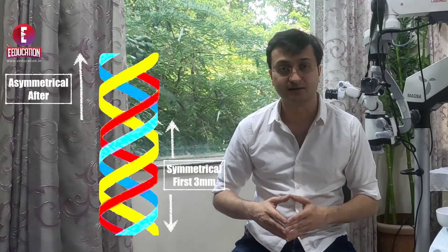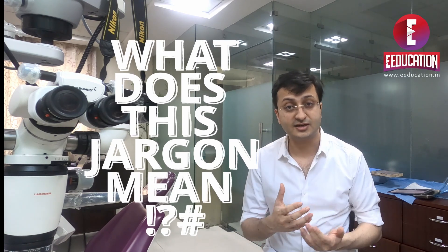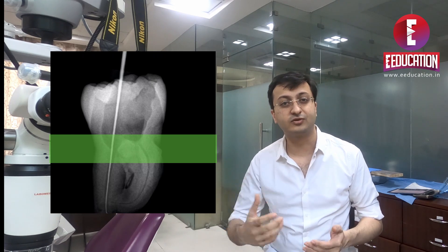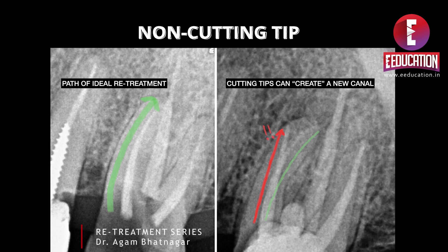As far as the rest of the construction goes, it is a triple helix which is symmetrical for the first 3mm, beyond which it becomes asymmetrical. This means we are talking about a file which will be friendly to the dentine and would not keep removing from the cervical area which needs to be conserved. Another important aspect is the non-cutting tip. An instrument with a cutting tip risks transporting the canal or creating a new path, as seen by the red arrow on the x-ray. A non-cutting tip ensures this problem does not happen.